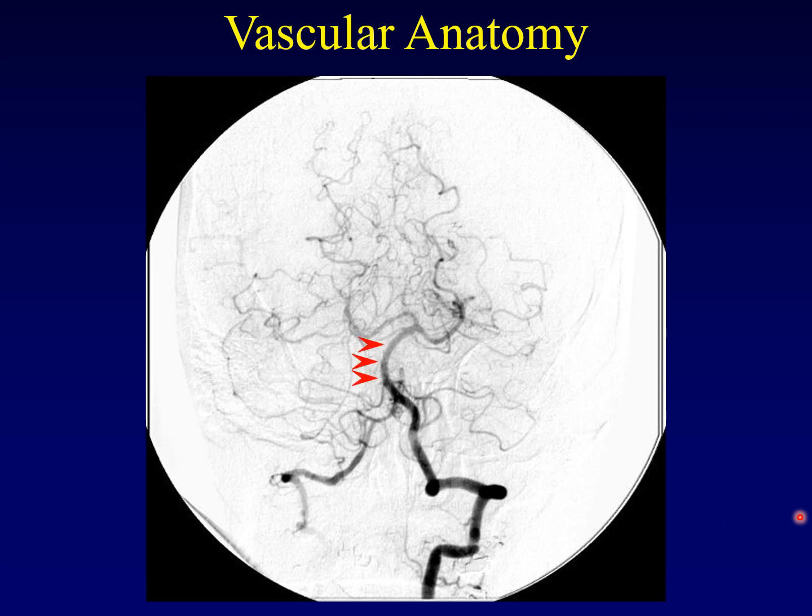So what's this artery here? Well, once the vertebral artery meets its counterpart from the other side, it forms the basilar artery. One question that I get asked a lot is, why is the other vertebral artery filling? Shouldn't it be flowing superiorly, just like this side? Why do we see any contrast in it at all if the injection was on the other side? The answer is that we're injecting so hard, we're refluxing contrast back down and forcing this vertebral artery to flow retrograde for a little while we do the injection. Don't worry, once we stop injecting, it'll start flowing forward once again.